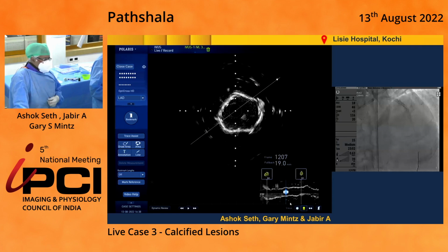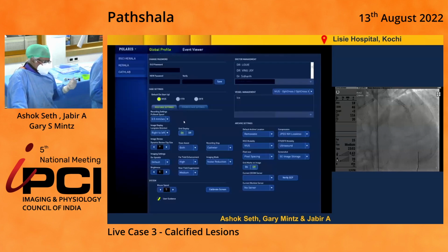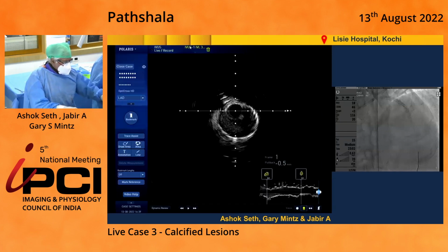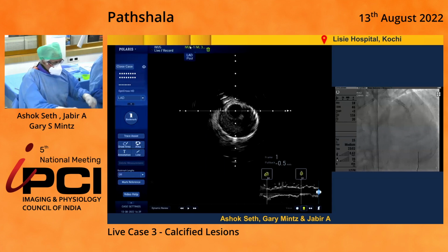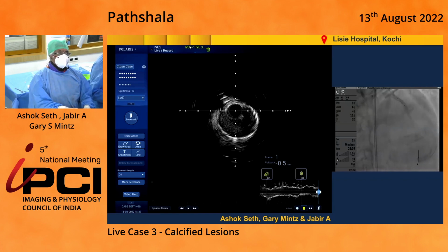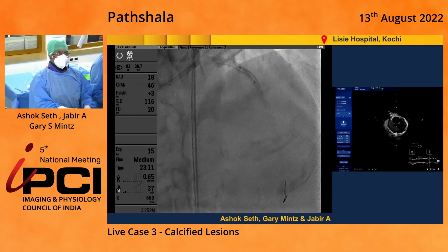And often at times, as you've seen with the non-compliant balloons, if you keep it up for 20 seconds, you suddenly see the lesion giving way. At this stage, you always want to be sure that you've got all your accessories around you for any bailout devices that may be needed, which we don't think we would, because I think we're appropriately sized to the vessel. And all we're doing is exerting pressure rather than doing anything more. We're not over-expanding that lesion. So here I was taking it up. There we are, centering it at the appropriate place, and let's go up.